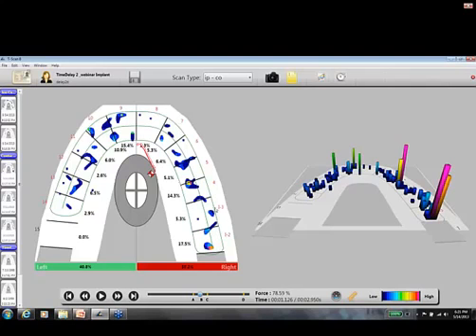If we have implants here on 2 and 3, think about it. Where would we want our balance? We'd want this center of force trajectory moving off to the left, because we'd rather load this side than this side over here where the implants are to protect them. So it's all about protecting the occlusion.